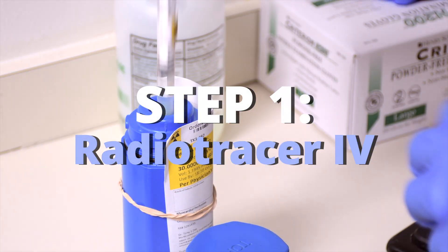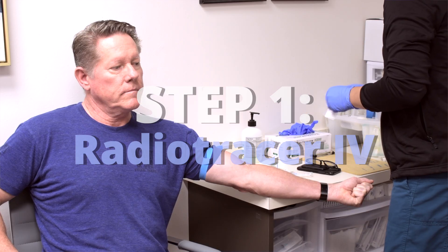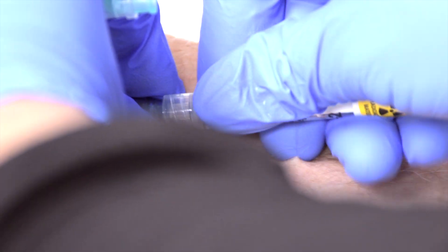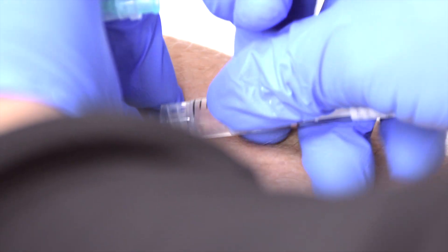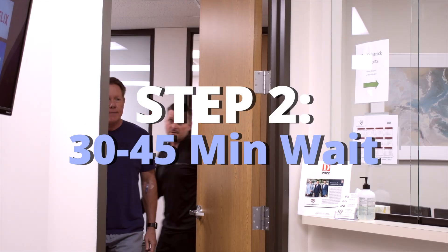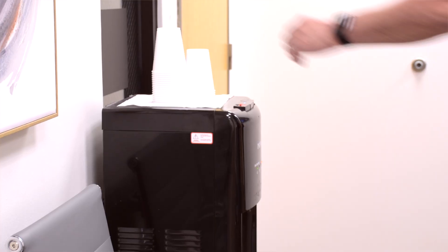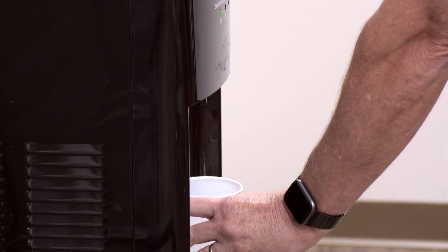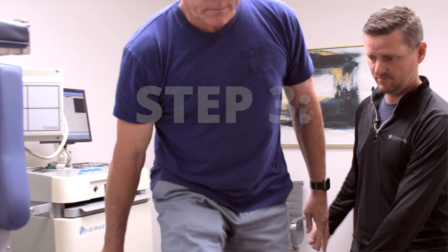First, our technician will take you back to administer an IV with saline that contains a small amount of radioactive tracer. The injection is perfectly safe and allows your heart function to be better detected by the imaging machine. The injection doesn't have any effect whatsoever on kidney function or anything else in your body. After this, you'll be directed back to the waiting room for 30 to 45 minutes — water only at this time. This wait time allows the heart to take up the medicine and clear out of the surrounding organs and tissues, so an accurate image of the blood flow to the heart can be obtained.